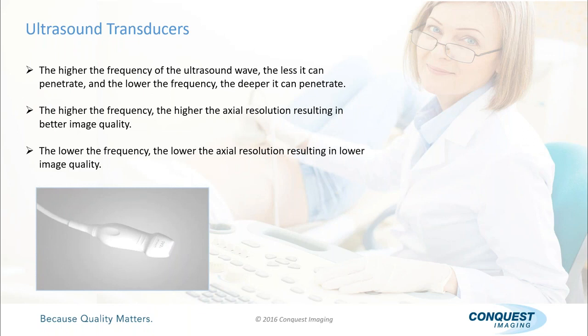One of the fundamental principles that we like to talk about in ultrasound has got to do with frequency. Frequency is a funny thing, okay? The higher the frequency, the less it penetrates, but the better the resolution. Okay, so you get this high frequency probe and you can see really good images, but you have probes that will only go this far into your phantom.